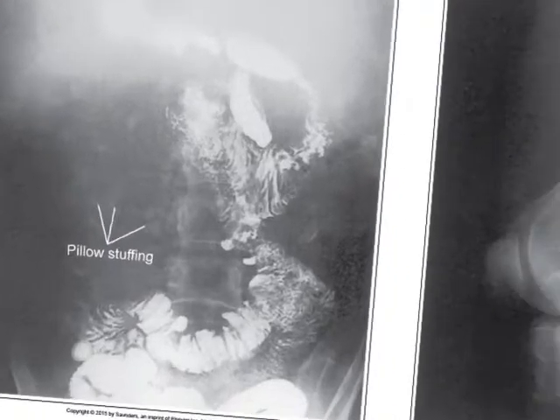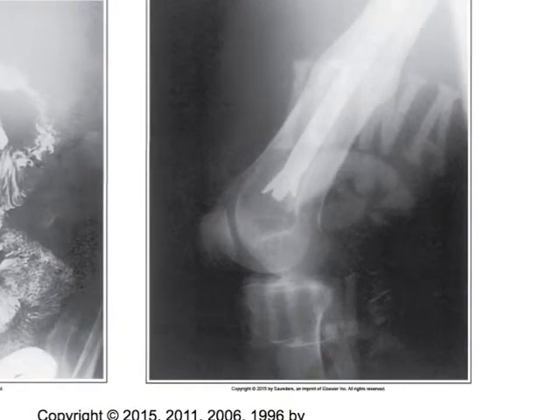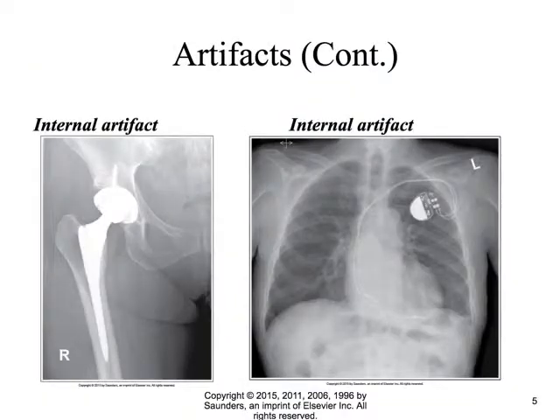Looks like they have some kind of weird parasitic disease or something. Here we can see the state of Iowa. Proudly displayed on this person's femur. If you're walking around in sweatpants that can show up on x-rays, that might not be good material. Like whatever they used in that ink on that sweatpant may need to be rethought.